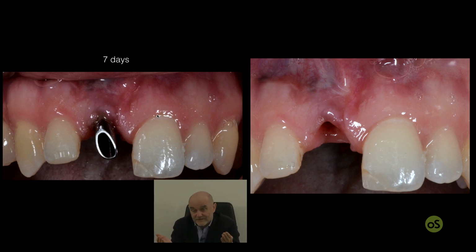resolved. And this is very critical, because if I improve the quality and the thickness of the soft tissue here, I can also reduce the thickness of the graft, but I also can improve the stability of my flap once it is coronally advanced, and so it will remain stable because it has good thickness of keratinized tissue to start with.